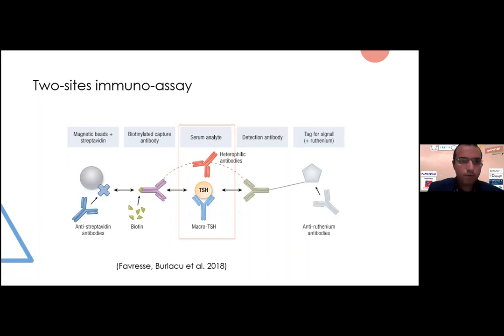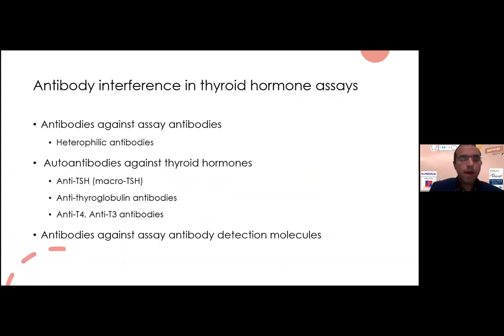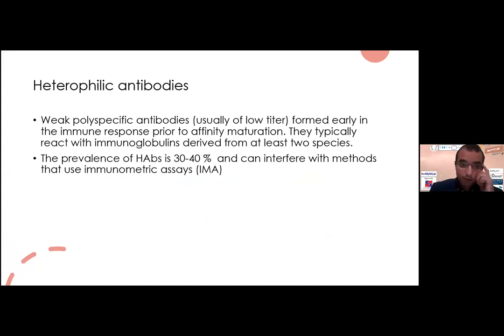Dr. Samir has shown us the two-site immunoassay, involving anti-ruthenium and anti-streptavidin. We are now more concerned with heterophilic antibodies and macro TSH. Antibody interference in thyroid hormone assays may be due to antibodies against assay antibodies, against thyroid hormones, or against assay antibody detection molecules. Heterophilic antibodies are weak, poly-specific antibodies formed early in the immune response before affinity maturation. They react with immunoglobulins derived from at least two species. The assay antibodies present in the kits are mostly animal-derived, for example from mice, so we expect them to interact with these kits.